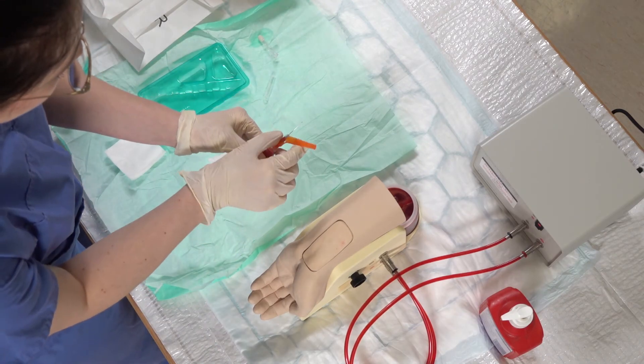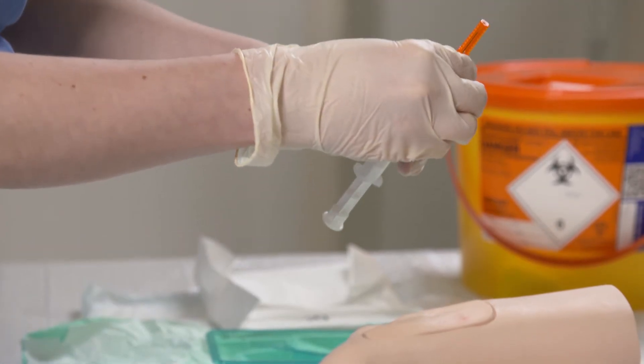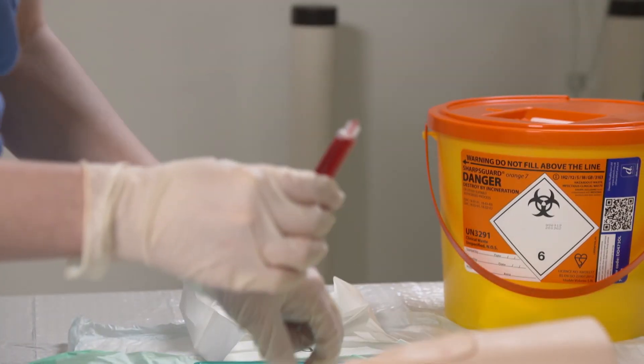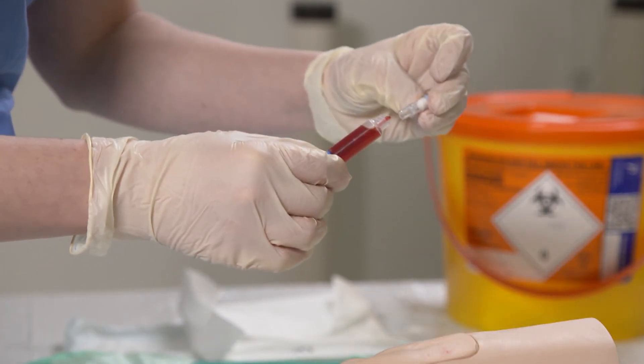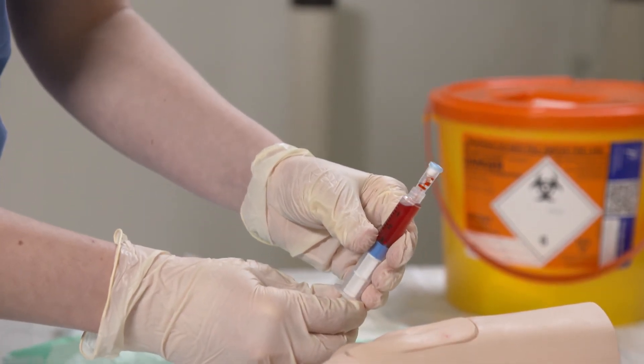We've put the cap over the needle and then remove the whole needle, placing it into the sharps bin. Then we can put this cap on top of the syringe and using this, we can expel any air into that cap.